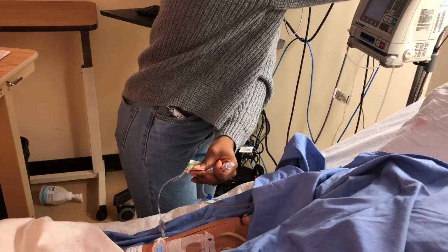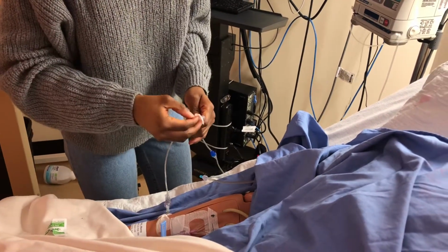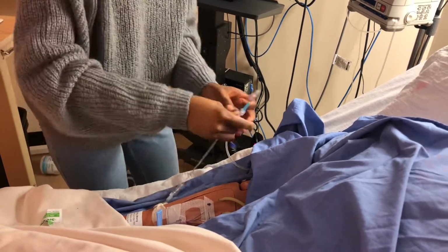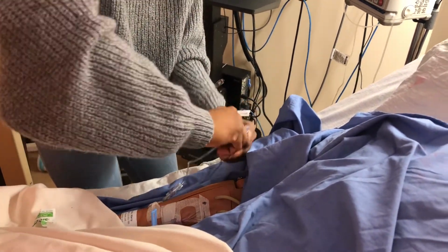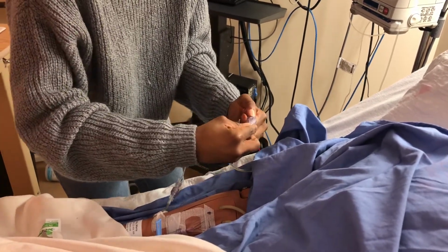So I'm just gonna silence this. So now I will alcohol swab this. 10 seconds, leave to dry for 15. And then take this, just take this out. Now I can attach it here.